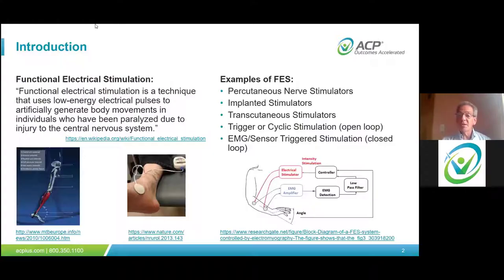We're going to be discussing primarily the use of transcutaneous electrical stimulation. And that means that we have 2 electrodes or more that will be delivering a charge through the skin to the adjacent tissue to help cause stimulation of the nerve. And it could be either a sensory or motor nerve that then causes the muscle to contract.